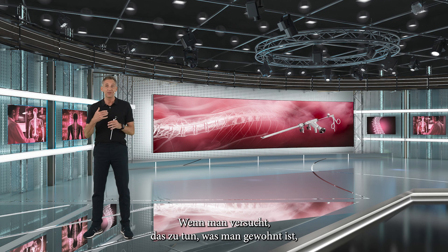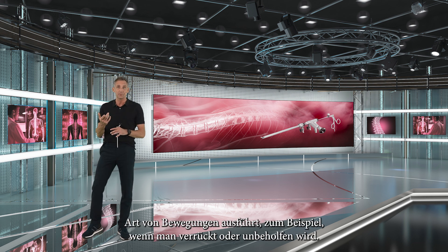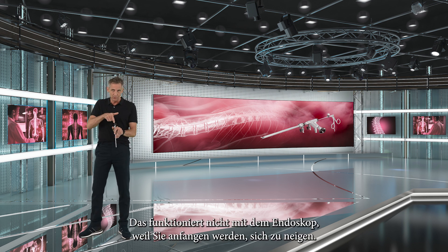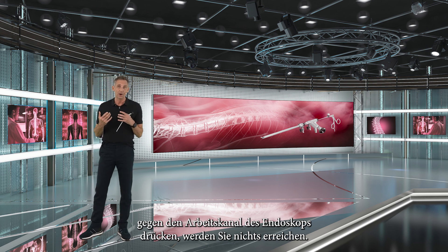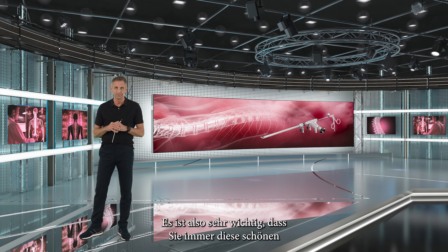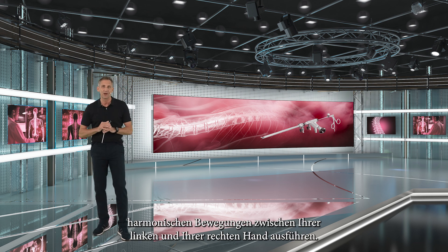When you try to do what you have been used to when working with the microscope — going with your instruments and doing those kinds of movements, for example going cranially or caudally — this will not work with the endoscope, because you will start to angle your instruments against the working channel of the endoscope and you will not get anywhere. You may even only cause damage to the instruments. So it's very important that you always have these nice harmonious movements between your left hand and your right hand.